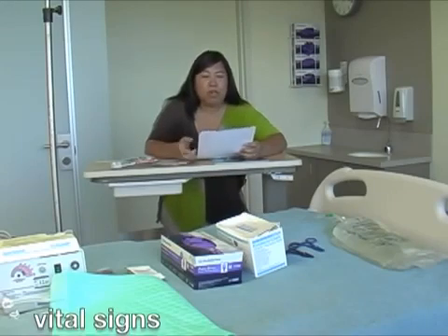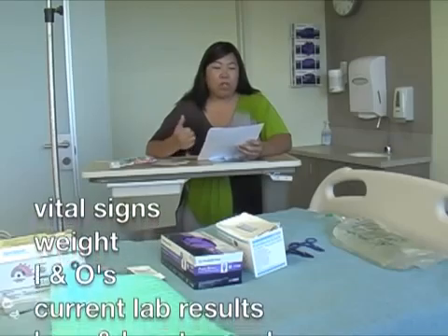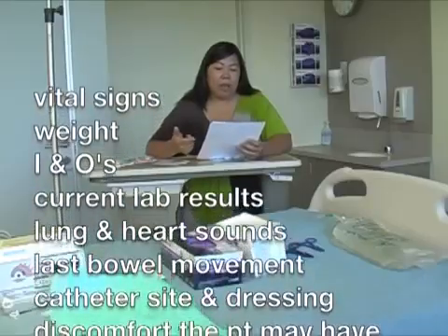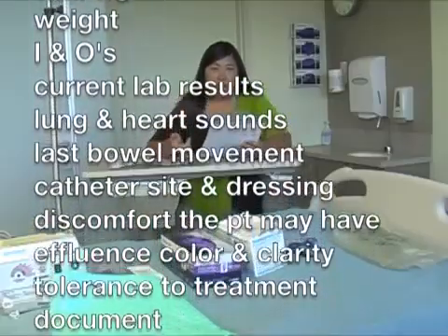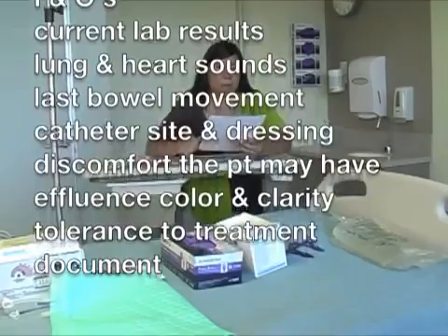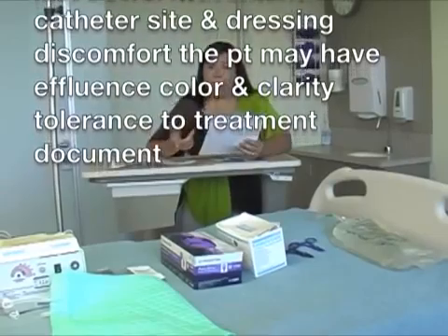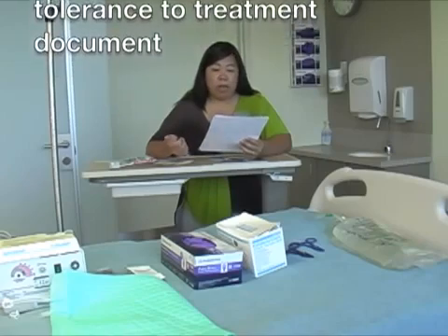Now, what you need to do first is obtain before, during, and after treatment as needed the vital signs, weight, the I&Os, the current lab results. Make sure you assess their lung sounds, their heart sounds. And last time the patient had a bowel movement, the condition of the peritoneal dialysis catheter site and dressing, any discomfort noted by the patient, check the effluent color, clarity or fibrin. The effluent color should be about clear yellow. And patient tolerance to treatment, you need to know about that. And then after everything is done, document the I&Os and record in the Cerner.